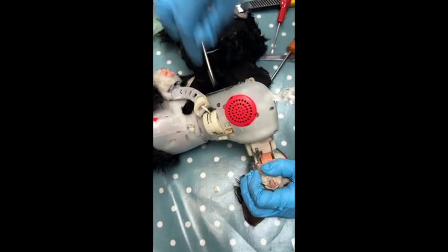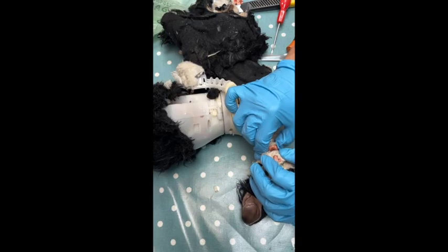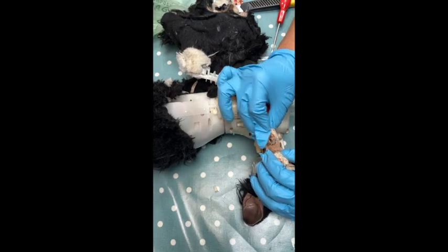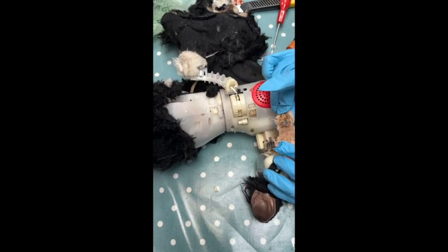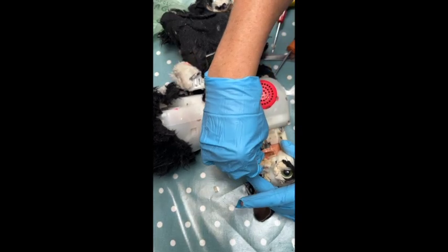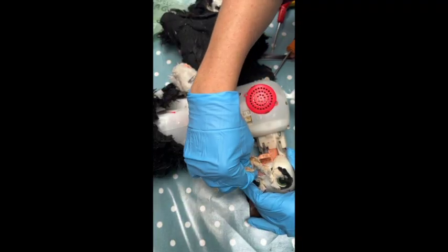Sure the head was attached, I think. Right. So we can lift the tongue out. And that's a very icky mouth. Interestingly, there's no holes at the back, so the food is really contained just in the fur. There's an attachment on a piece of elastic to hold it in.